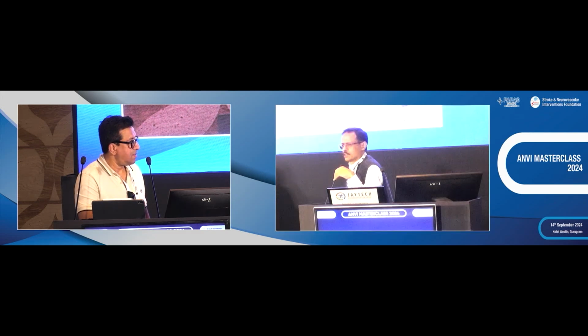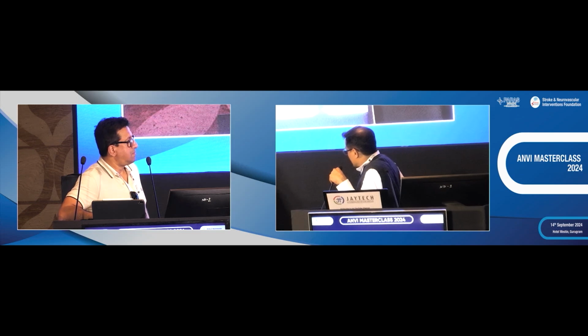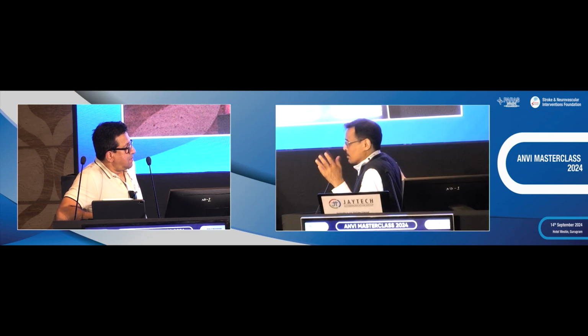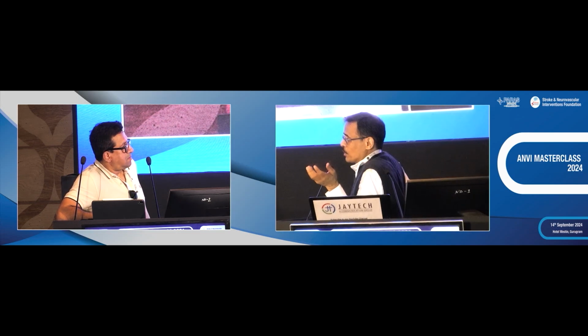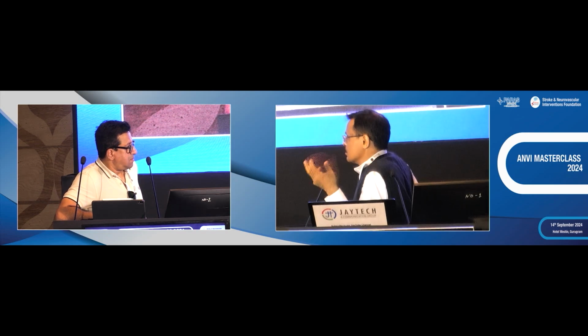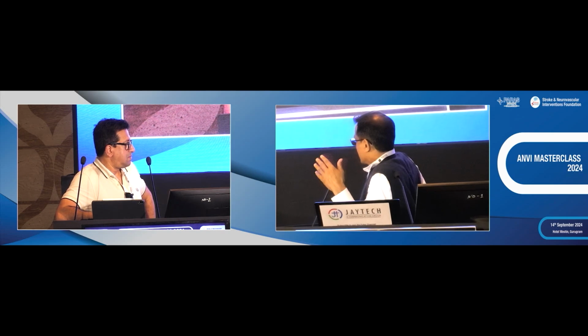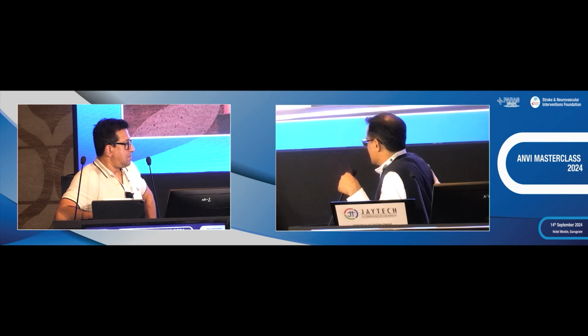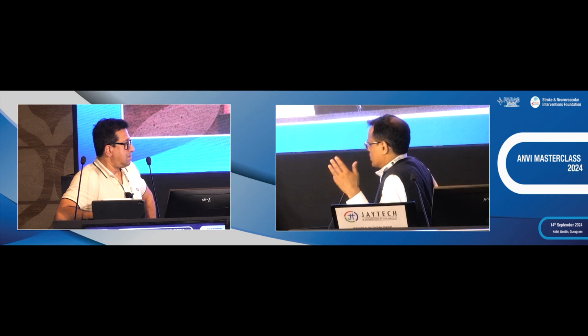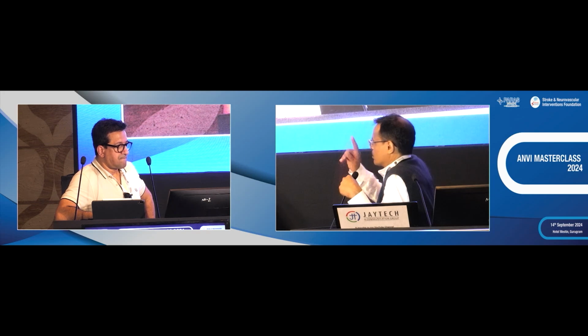But I think intrasaccular devices are here to stay. The challenge is getting over the learning curve in our circumstances, because even now in my department, for ruptured aneurysms, coiling is a very powerful, simple, straightforward and much cheaper technique, and the major block is actually expense. And since we are not using that many, we get reluctant to use more. But I think they are here to stay. The technology is getting better, more are coming into the system, so all of us need to get over the learning curve. Just one last question to Tufail.